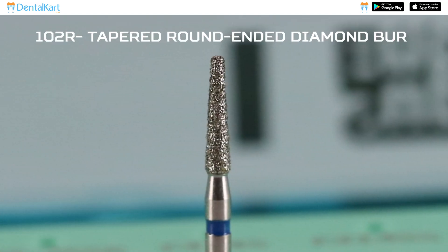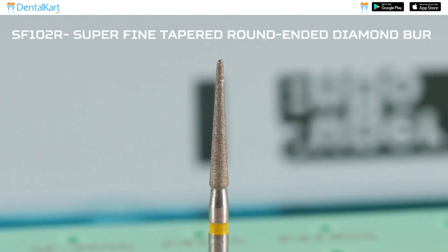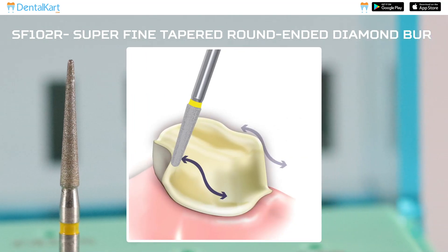1-2 R Tapered Round Ended Diamond Burr: For creating a deep chamfer margin on the lingual or palatal surface of a PFM crown. 1-2 R Super Fine Tapered Round Ended Diamond Burr: This burr is used after the tapered round ended diamond burr for smoothening the chamfer margin.